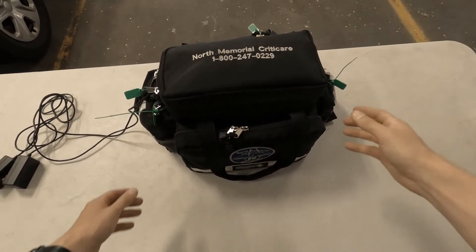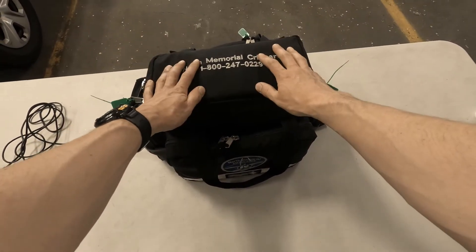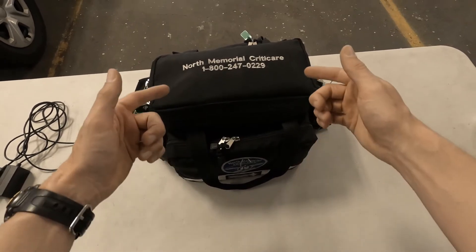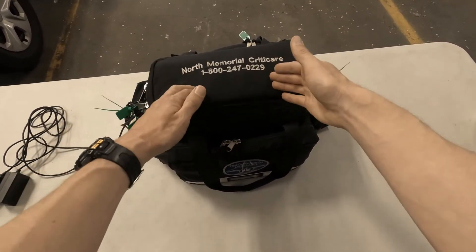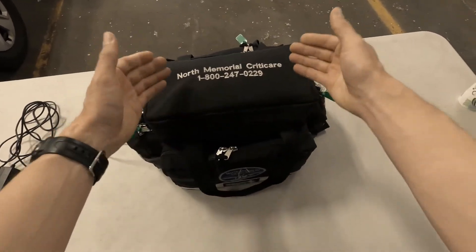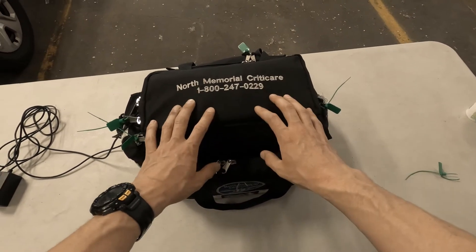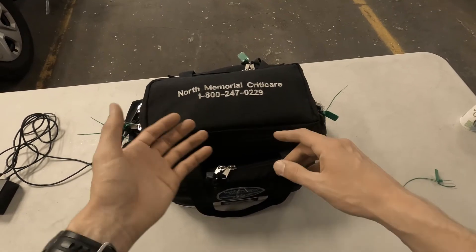Hey everybody, welcome back. I wanted to take a little time to go over the critical care first-in bag, or the black bag. Now if you've been in critical care for a little while, you obviously know that this went through quite a few changes. Initially the point was to accommodate the new pumps, but really the impetus for changing it was to prevent some of the problems that we were running into at the hospitals.